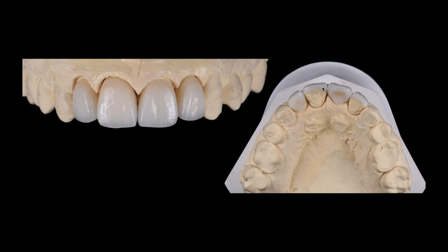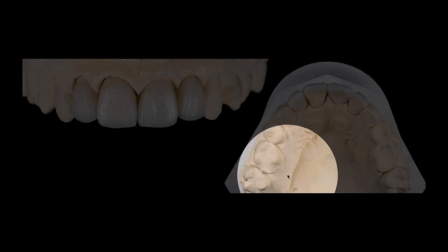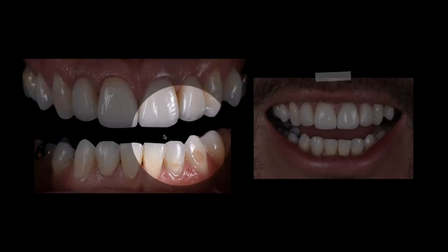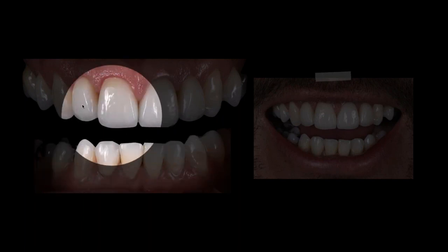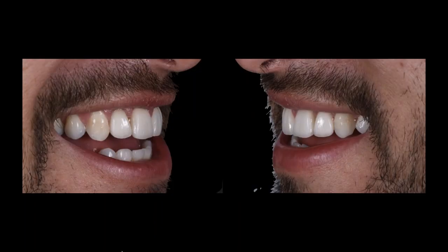So you'll notice the difference in the materials as far as I have full coverage and veneer. And I think most of us know that these are the most challenging cases that we really work through these days, where we have lots of space and a little space, and we have to kind of manage through both of them. They become challenging. And don't forget, we did a full coverage on the lower. This was also the ST zirconia material and layered with the M9, but obviously a different shade than the upper. I had to really blend this more into the lower teeth, whereas the upper, I was trying to brighten them up and whiten them up a little bit more to make them feel right for the patient.